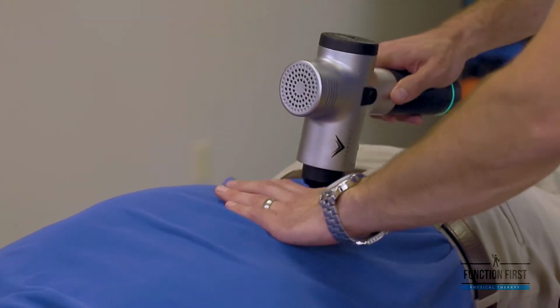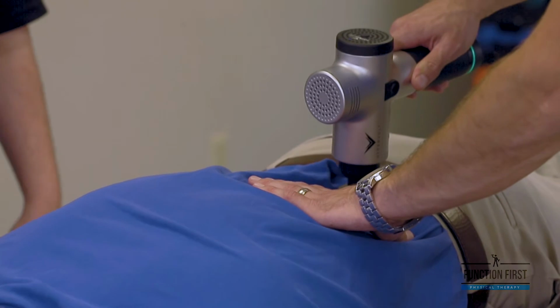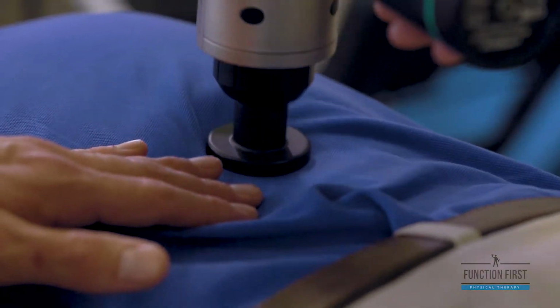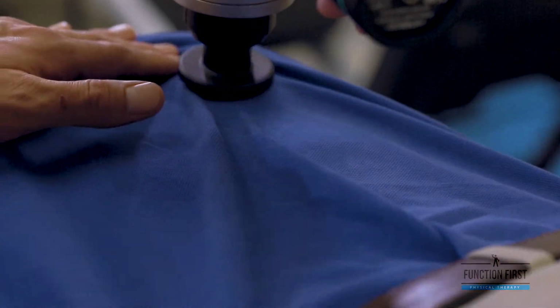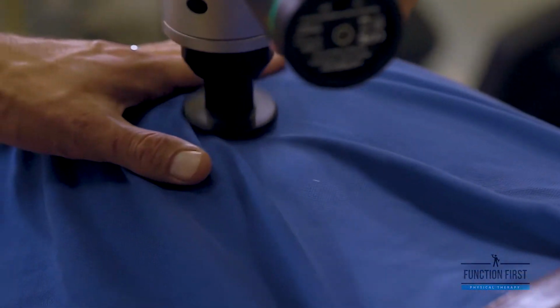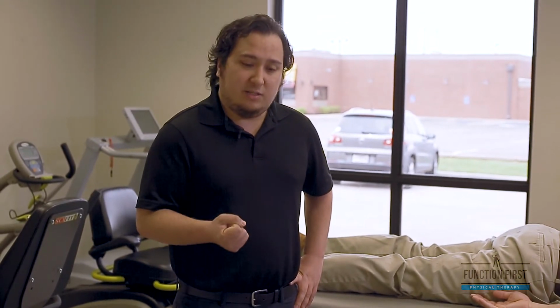Yeah, and also like Matt was alluding to, sometimes they're very sensitive to the Hypervolt, and this will actually break up that sensitivity. A lot of pain and sensitivity kind of go hand in hand, and even if they can't handle the flat or the rubber tip, we can put more padding down, like a towel or hot pack cover, something like that, and it'll really let us work on that tissue in a pain-free way.